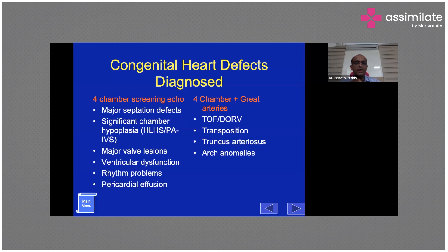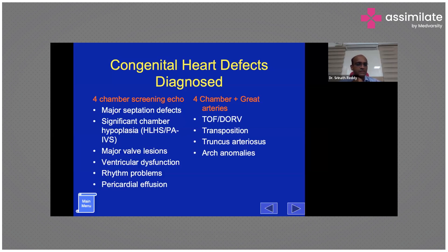In the four-chamber view you can also assess ventricular function, which is very important. Rhythm problems — whether there is a one-to-one relationship — can be assessed using pulse Doppler across the mitral valve. Pericardial effusion is another important finding that can be significantly assessed in the four-chamber view.